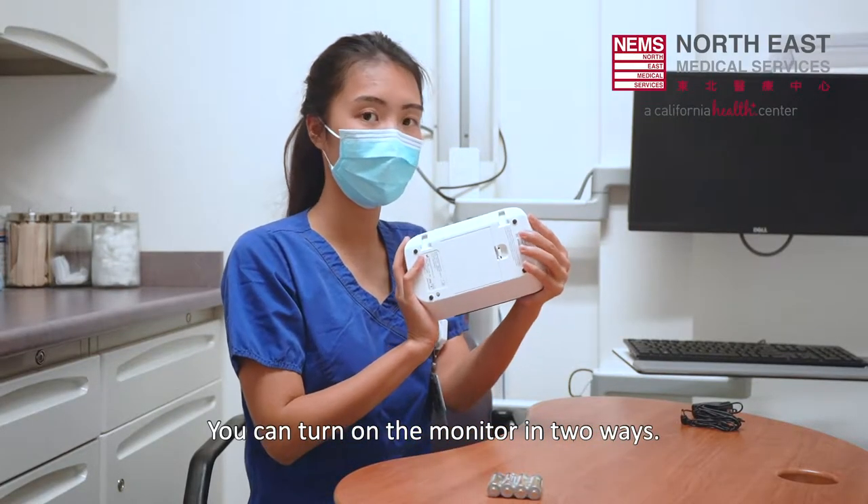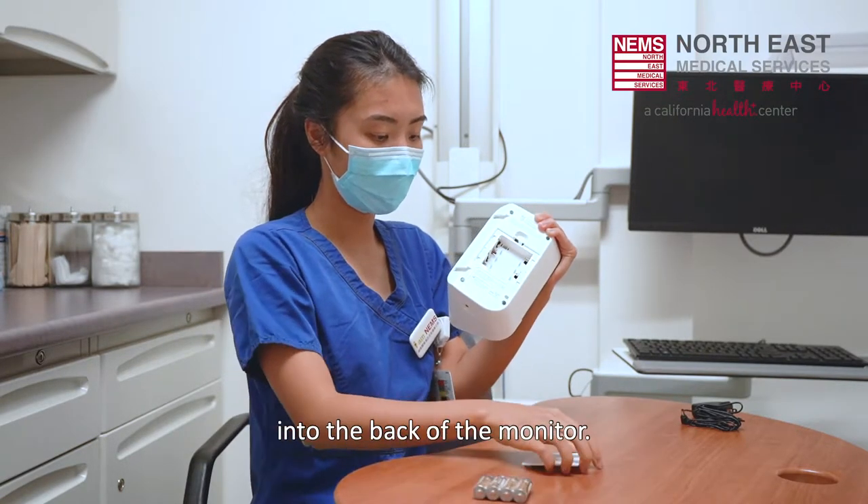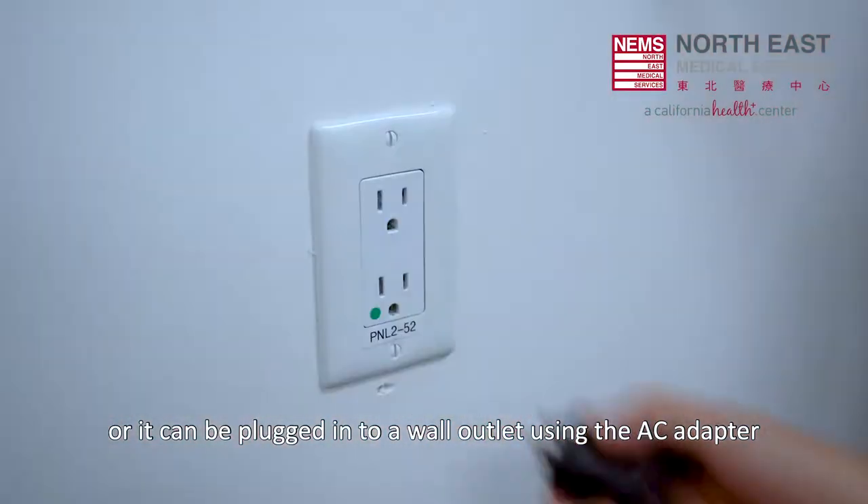You can turn on the monitor in two ways. It can be turned on by inserting the batteries into the back of the monitor, or it can be plugged into a wall outlet using the AC adapter.